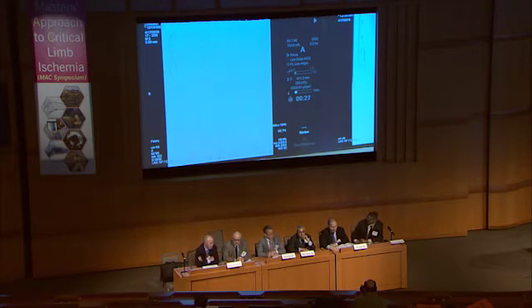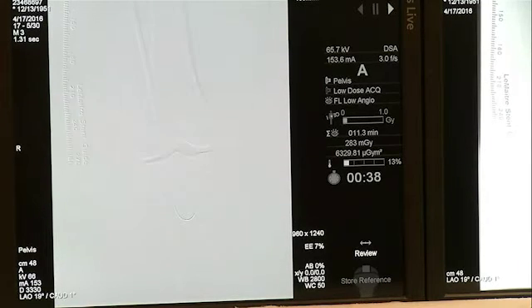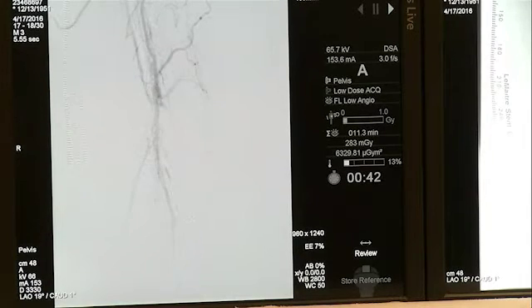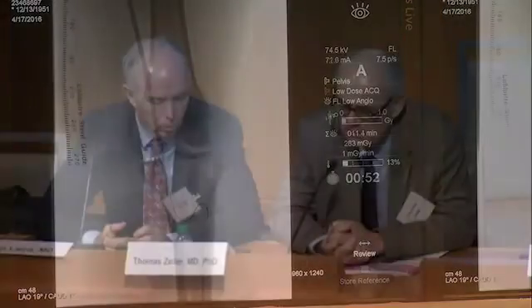So now the balloon is at the knee joint, as you can see, and there are still some fistulas. Some of these may be coming from the profunda. It's really hard to say. Yeah, but Mehdi, you did a selective angiogram after you crossed the occlusion of the proximal below the knee arteries, and there it was nicely visible that there had been no additional AV fistulas.